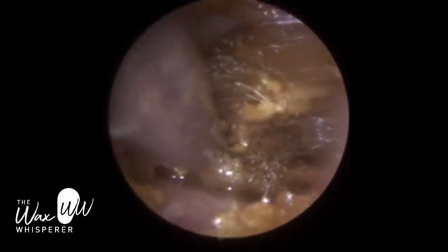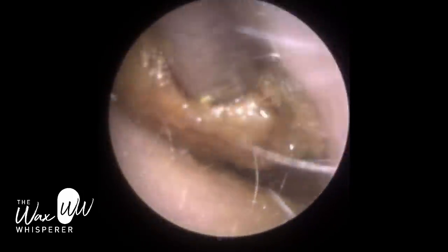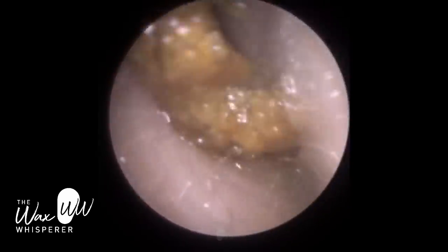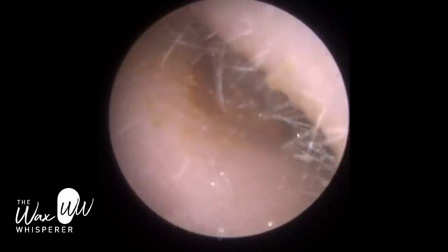On this side, the patient was very adamant that she didn't have a perforation, so we put some more drops in. The patient had been using drops on this side anyway. The oil has really helped — it's lubricated the canal wall and bound this plug of wax together in a solid mass, making it easier to extract.